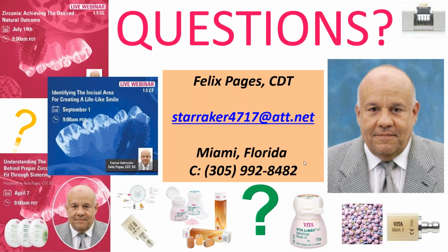no less. We do a lot of cases where the patient might have a lower fixed case with ceramic tissue and an upper denture. Because the lower denture will move too much, so they'll do an implant-based case here and a full denture. It could be an implant-supported denture, but that's acrylic, and so we try to match the ceramic with the acrylic. And it works perfect, but you've got to use 50 to 75% clear.